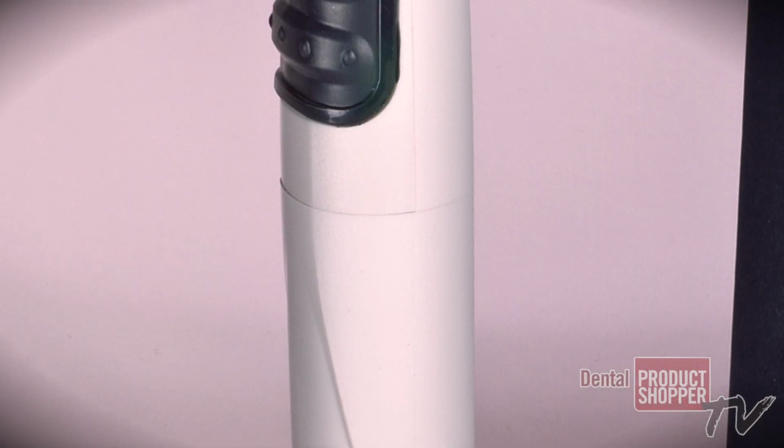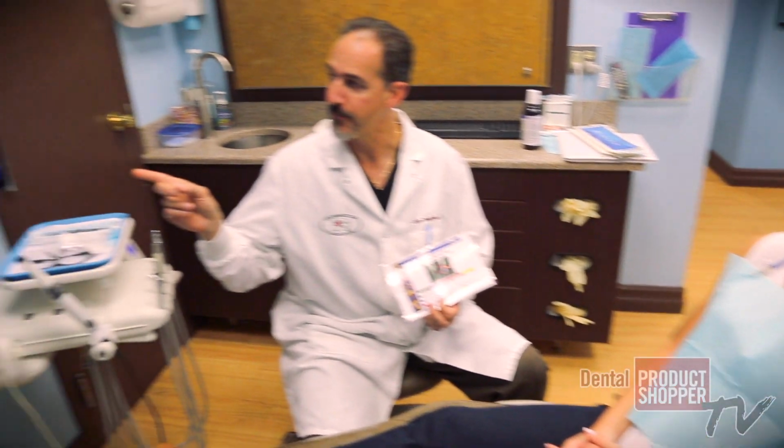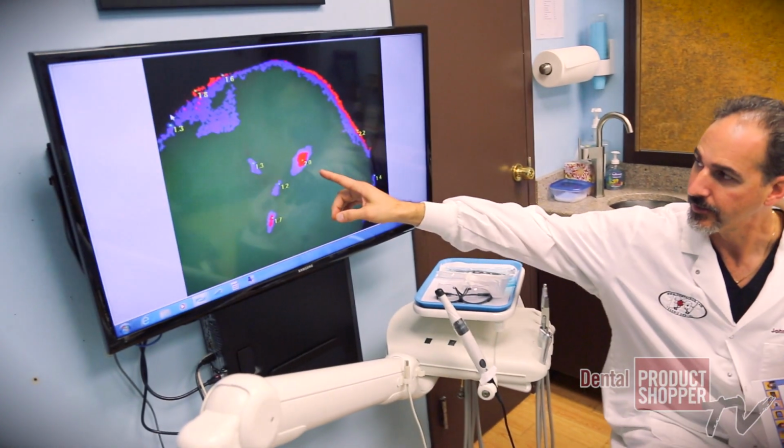Caries detection is another way of saying cavities. We're trying to see how deep the cavity goes within the tooth structure, and that is the benefit of the Spectra through Air Techniques, in the sense that they're able to come up with a number so that we can compare that number or value now and 6 months from now.